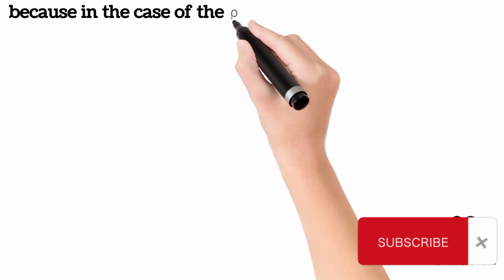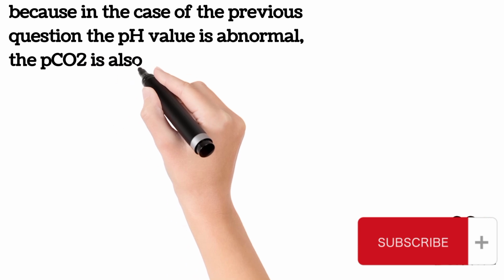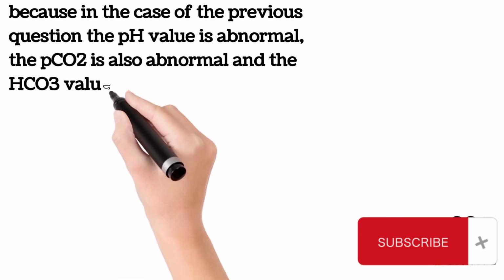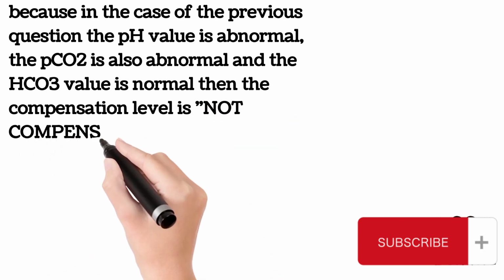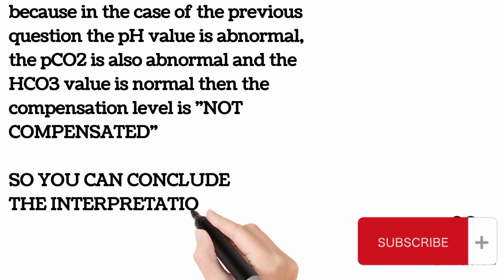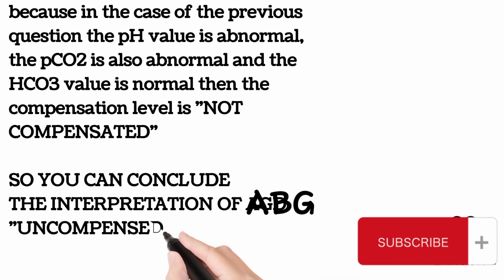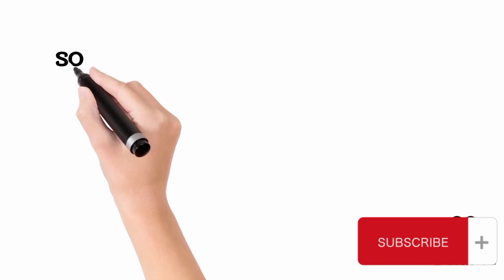Because in the case of the previous question, the pH value is abnormal, the PCO2 is also abnormal, and the HCO3 value is normal, then the compensation level is not compensated. So, you can conclude the interpretation of ABG: uncompensated respiratory acidosis.